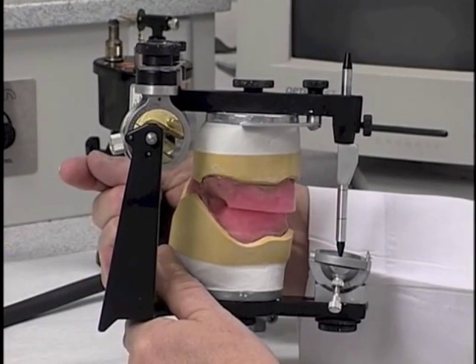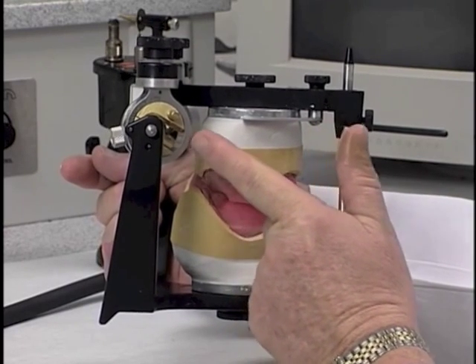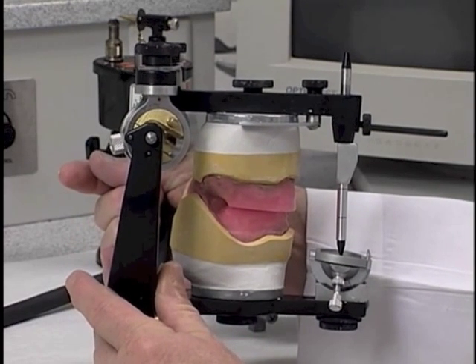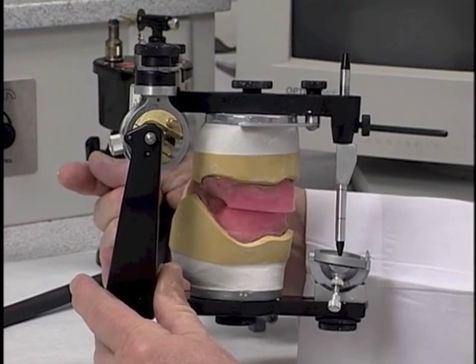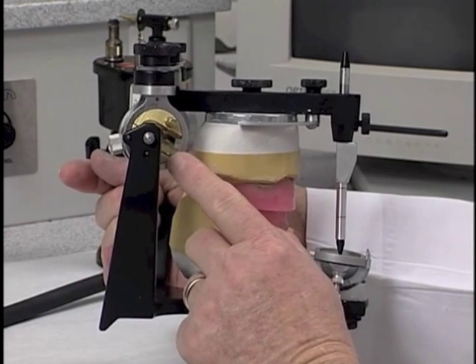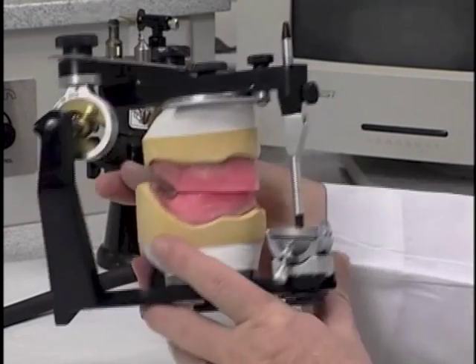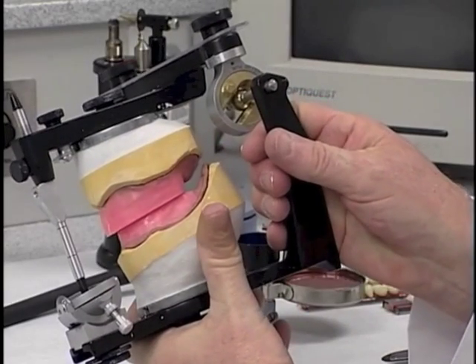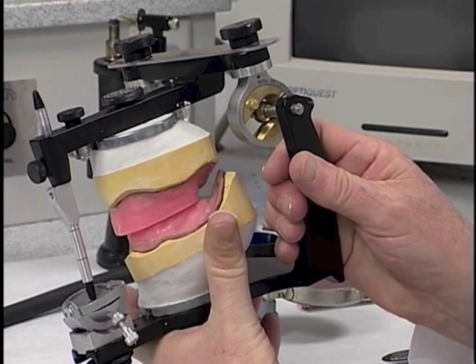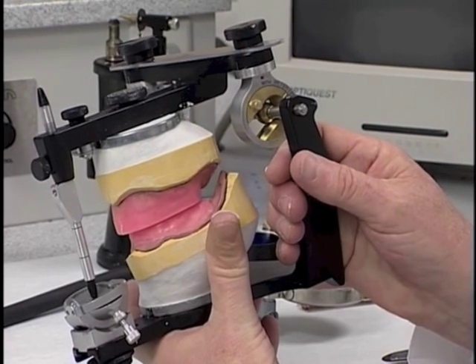From our protrusive registration, we achieved a horizontal setting for the condyle on the articulator, and on this particular side, which is the patient's right side, that setting is approximately 30 degrees. Consequently, from the protrusive, we found that the patient's condylar slant was about 30 degrees from the horizontal. We look at the other side, and we have a slightly steeper condylar inclination that came from the protrusive registration, and this one's about 33 degrees.